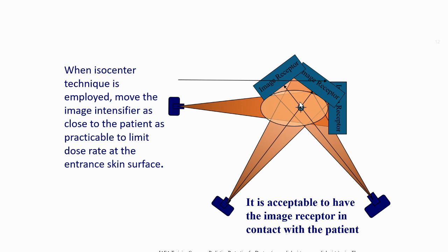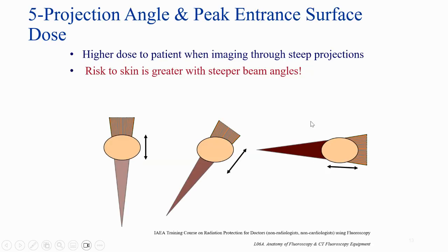So move the image intensifier as close to the patient as practicable to limit the dose rate and the entrance skin surface dose.